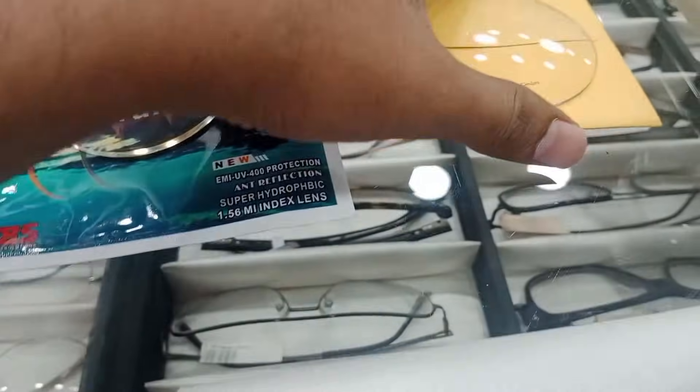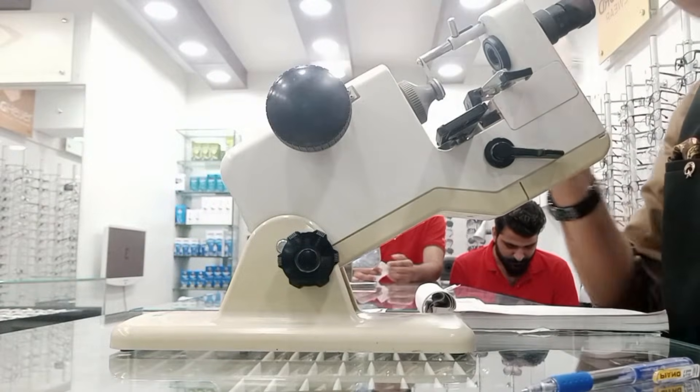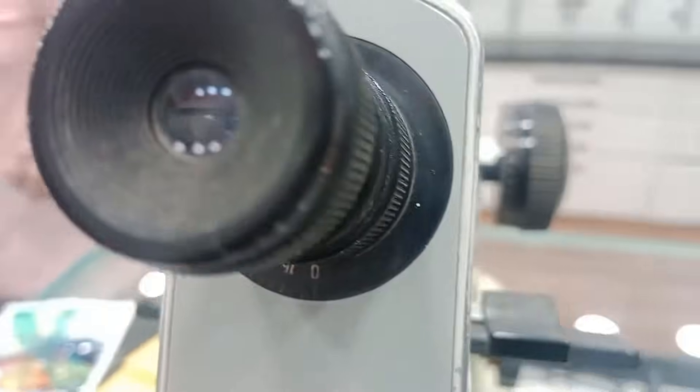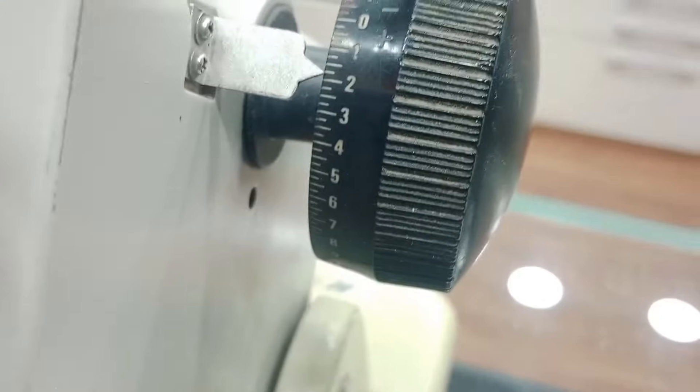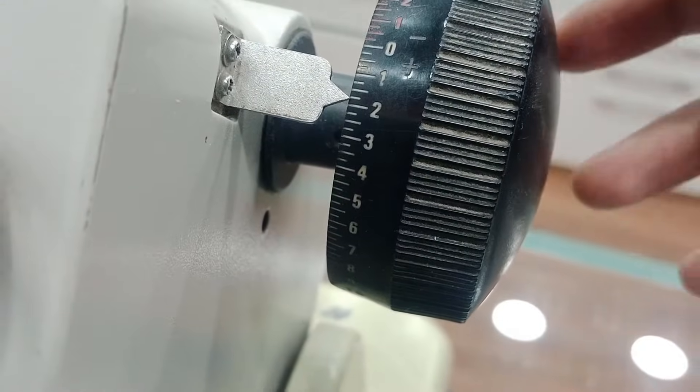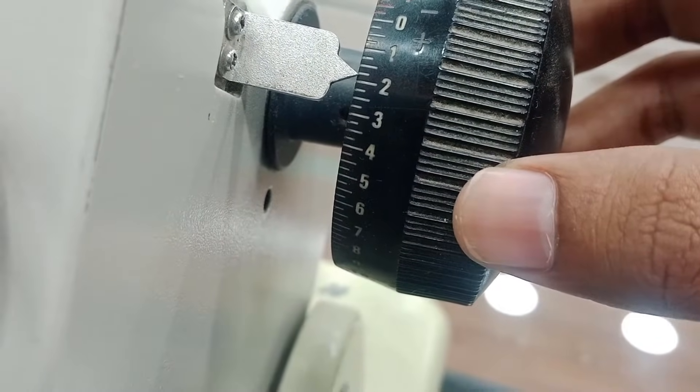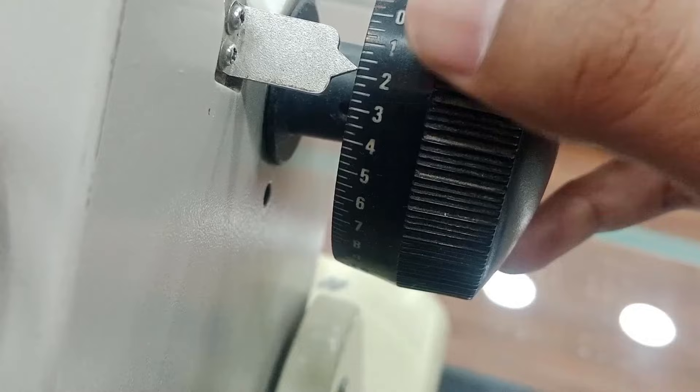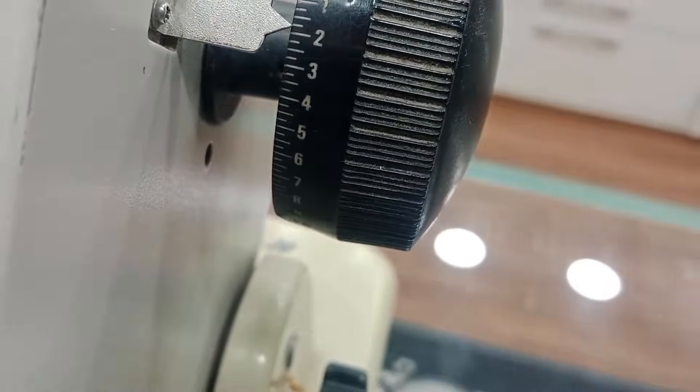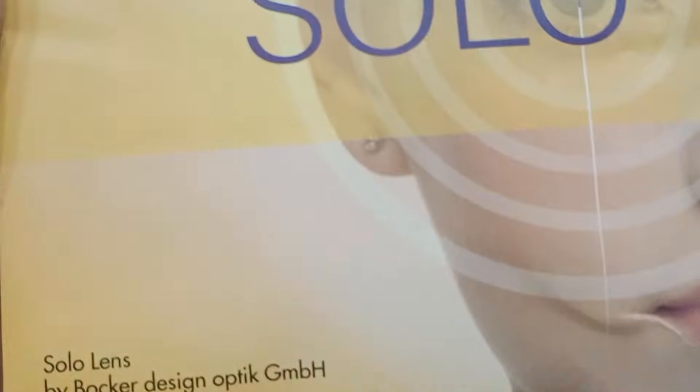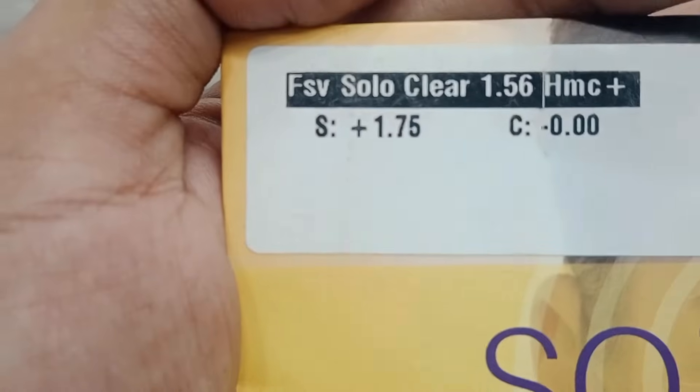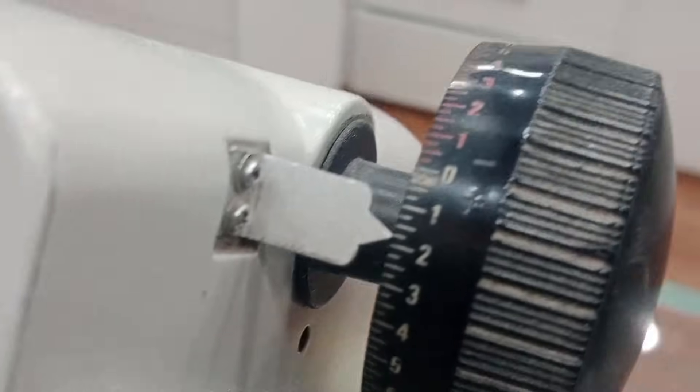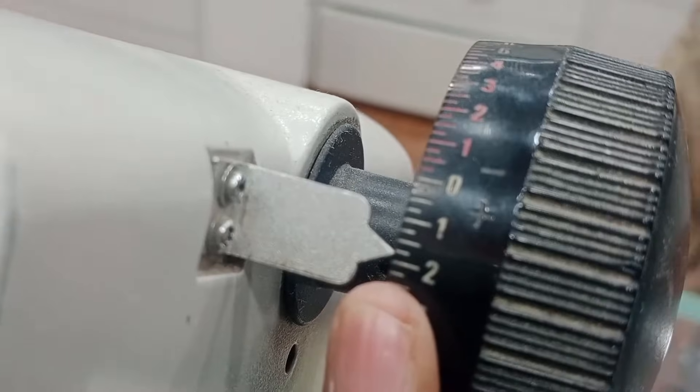Now another lens of unknown power. Let's put this lens and have a look inside. We don't have any meridian. It's just a spherical lens, and the spherical lens is clear at +1.75 because all the dots are clear. Yes, the power is spherical plus 1.75.